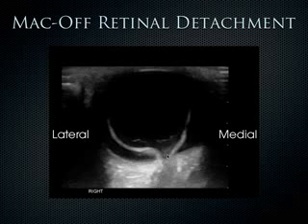So here's the optic nerve sheath coming down here, and if the retina is detached off the back of the eye at the level of the macula, then they have sort of less of a good prognosis when this gets lasered back down. The ophthalmologist comes along and uses lasers to get this retina to be attached back in the back of the choroid of the eye there. So that's a MAC-off retinal detachment, because you see it's really only tethered right at the optic nerve sheath.